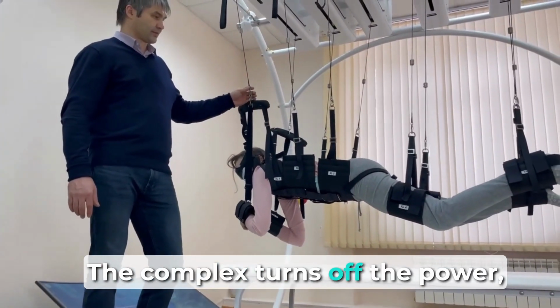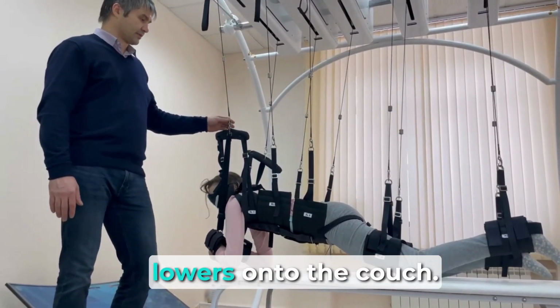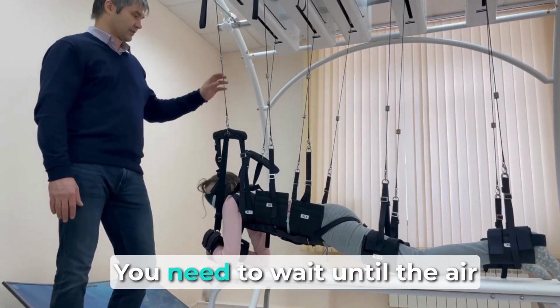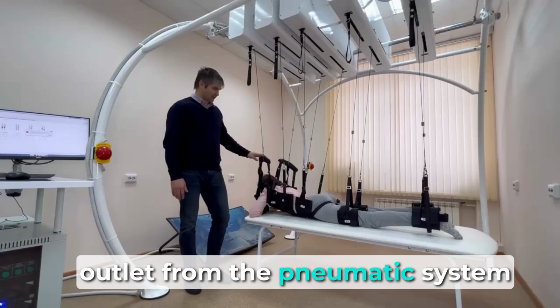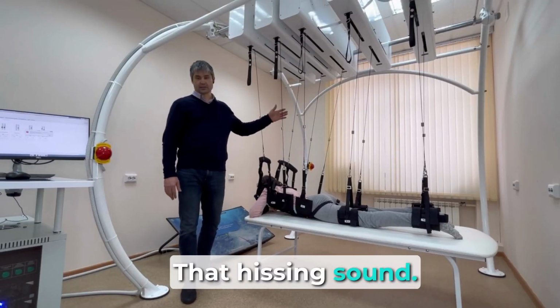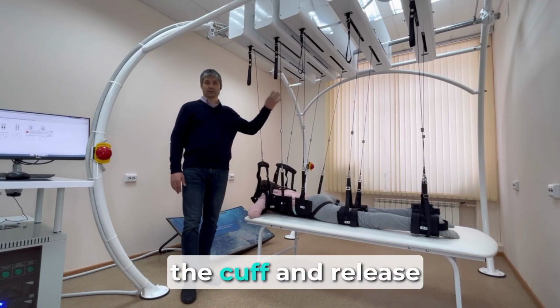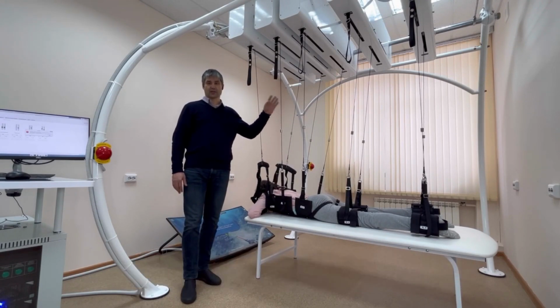The complex turns off the power, the distributors in it open, and the patient smoothly lowers onto the couch. You need to wait until the air outlet from the pneumatic system is completely finished, that hissing sound. After it finishes, all the cables will be free. It will be possible to remove the cuff and release the patient.